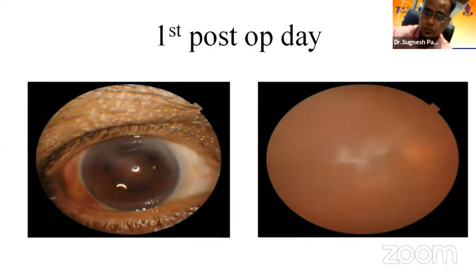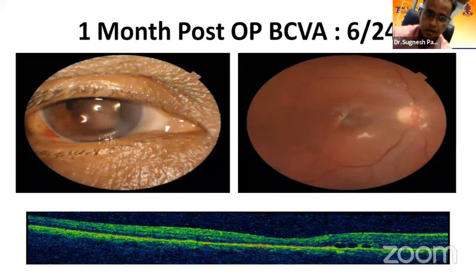This is the first post-op day. You can see the IOL is well in place. The iris was a bit dilated because of some trauma during the previous cataract surgery. The retina seems on in the silicone oil filled eye.